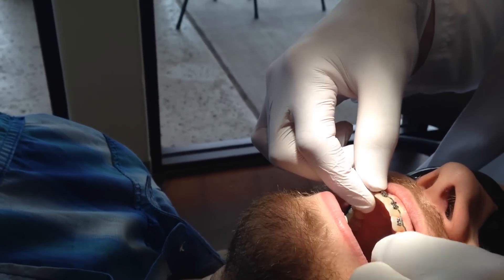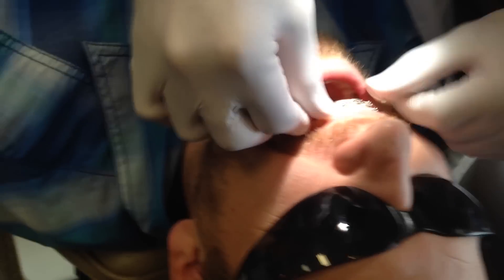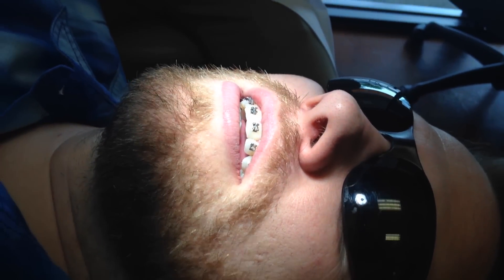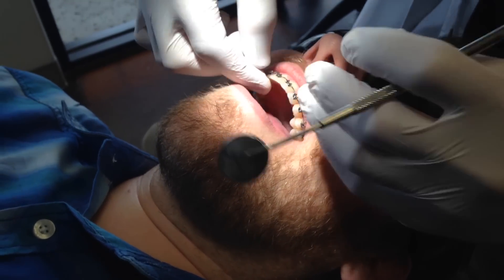It's already been 6 minutes and 36 seconds today. I'm keeping track of time. Is your finger blocking the camera? Yeah, partially — so it might be hard to edit out. It's done that quite a couple times. Feel the pressure. So it takes longer to do his mouth because it has more brackets — his is more complicated. Are the back ones harder to do?